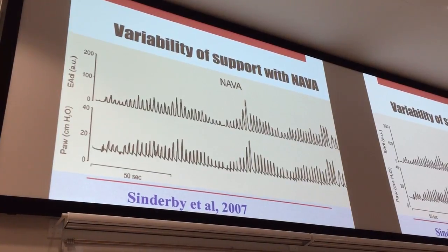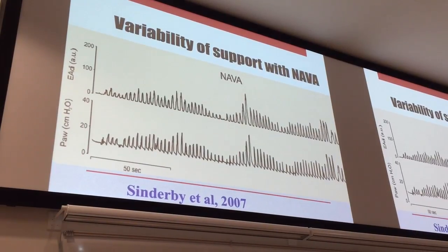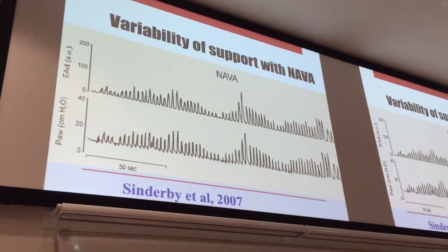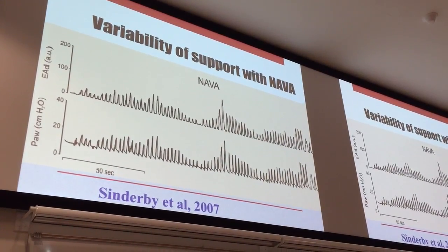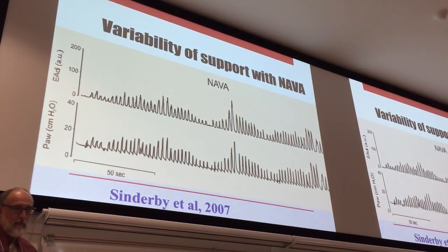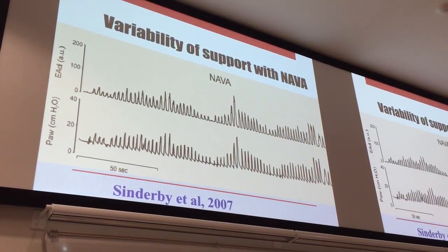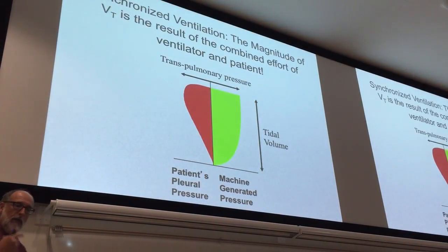Babies, and I've watched this with volume guarantee on targeted ventilation. Little buggers can generate 20 per kilo tidal volume if you bother them. And then you put positive feedback on top of that. That worries me a little bit. This pressure is getting kind of high. So I don't know. I think for non-invasive it's great. I remain to be totally convinced that we know fully what we're doing, and that the baby is quite as smart as we would hope that it is. But that said, more data needed.